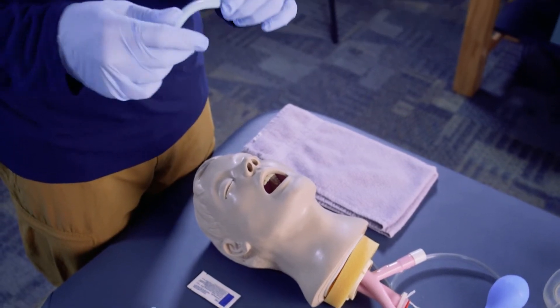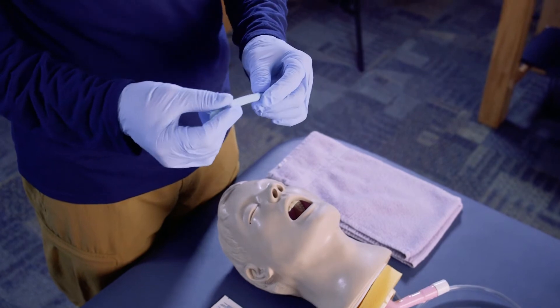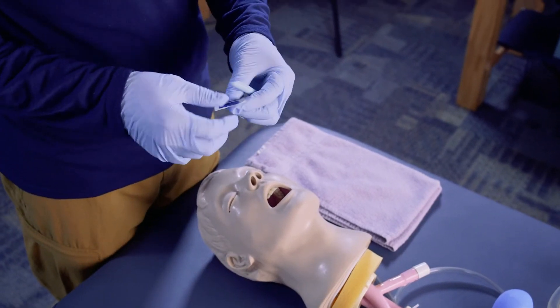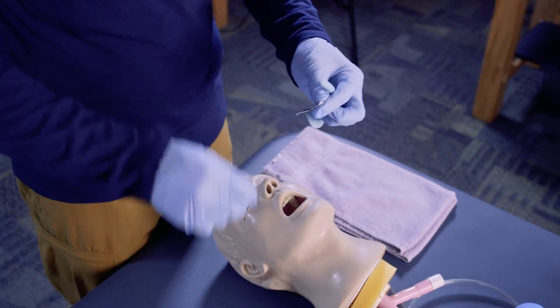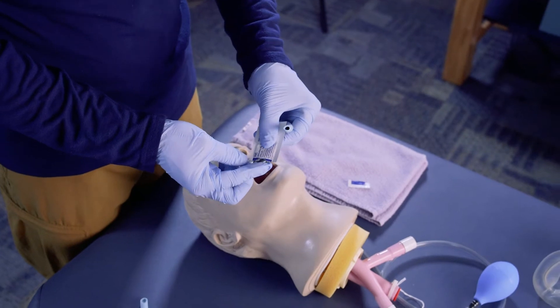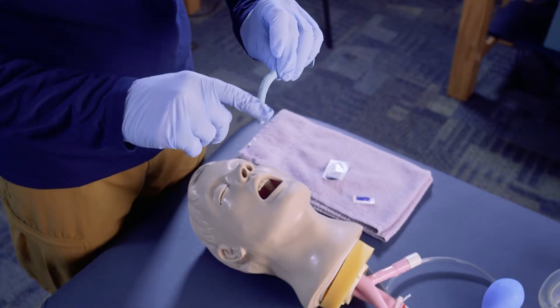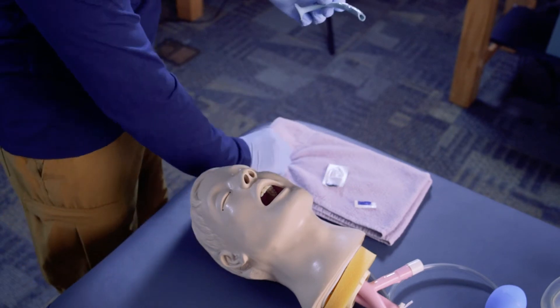These are made of a silicone rubber, which means they're sticky and hard to insert appropriately. So we want to use a little bit of water-based lubricant to ease it in. I'm going to take a little lubricant onto my glove and rub it over the tube, just at the tip, and that's going to allow it to slide in smoothly.